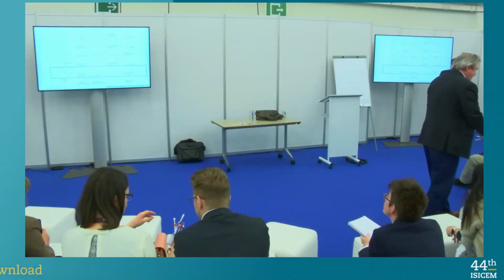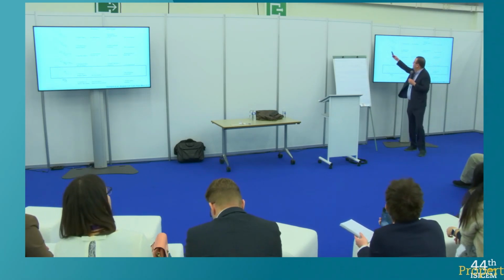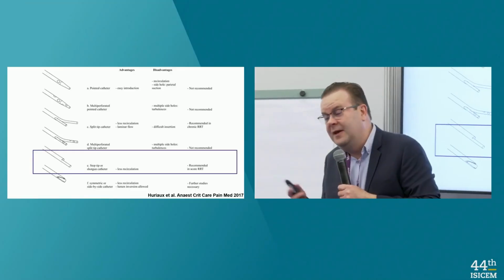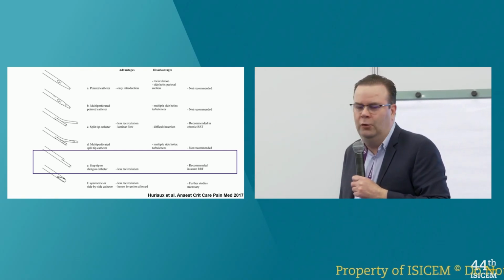Why? They love them because it's easy to insert inside the body, right? So these catheters are easy to insert, but what's the problem with these catheters? What's the problem of these side holes? When I was a fellow 25 years ago, I was using these catheters. What's the problem with these side holes?